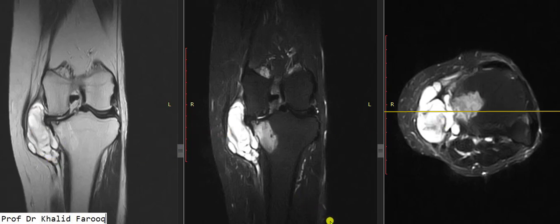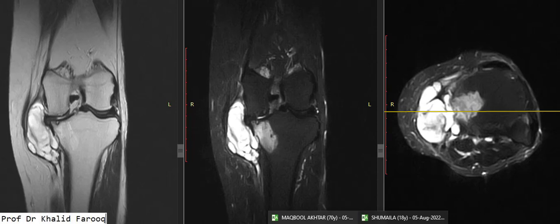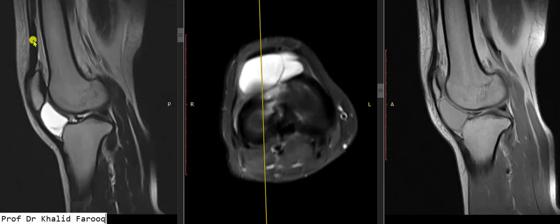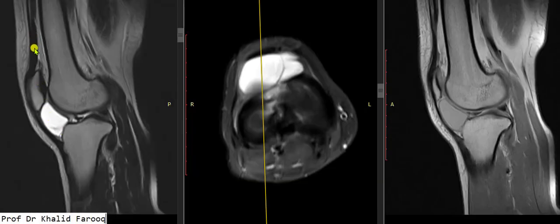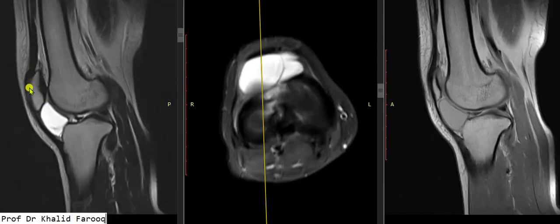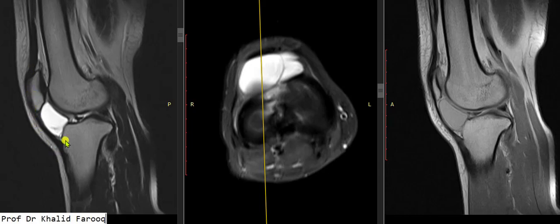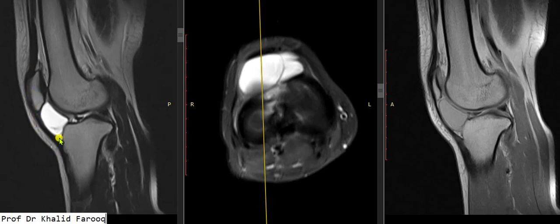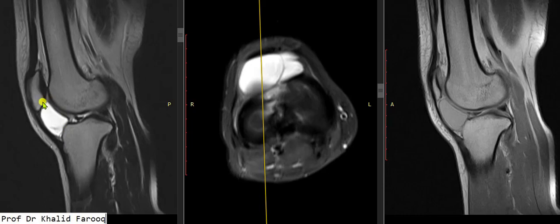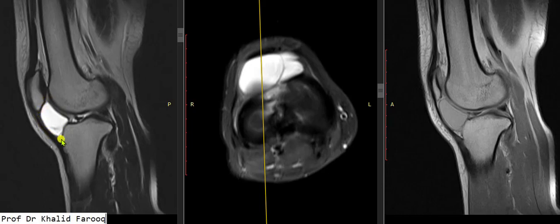And here we have another case. We can see this is the quadriceps tendon, patella tendon, and this is the area of the infrapatellar Hoffa's fat pad.